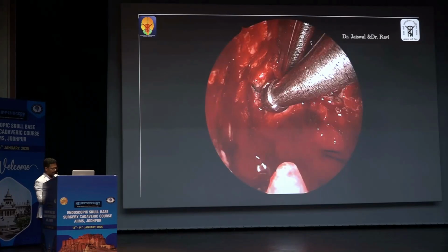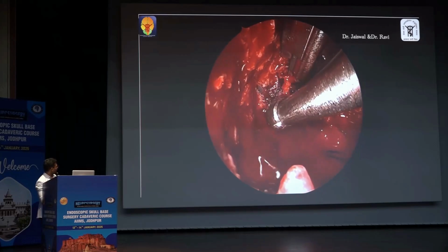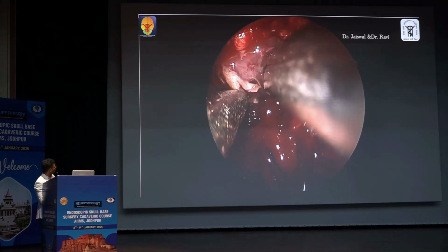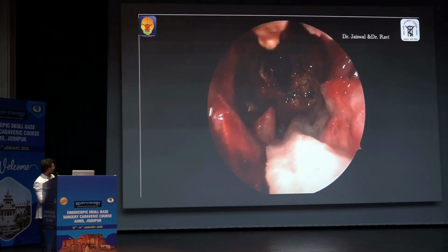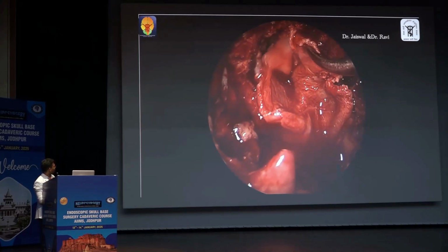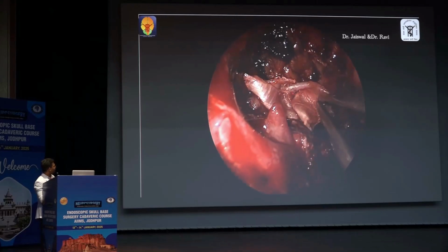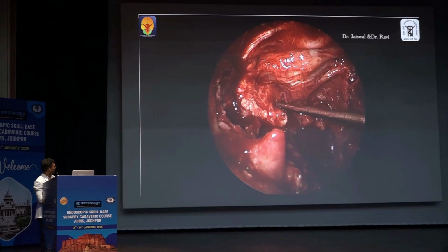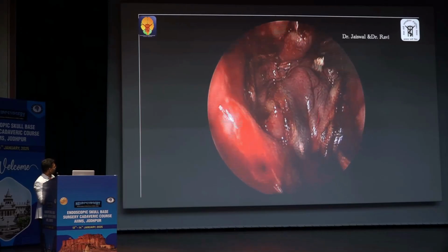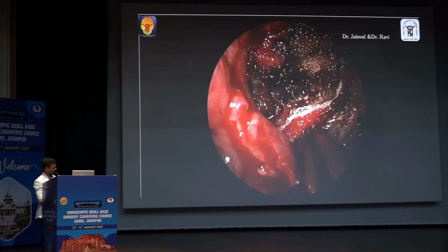This is the case of a planum meningioma. You can see the planum was completely exposed, and then dural incision was made and the tumor was removed. After tumor removal, we placed a layer of fascia lata on underlay technique first, then a small piece of fat followed by overlay fascia lata, and then we supported it with the Hadad. Again, you can see the blue color. There is a change in the color. This is again because of the venous congestion.